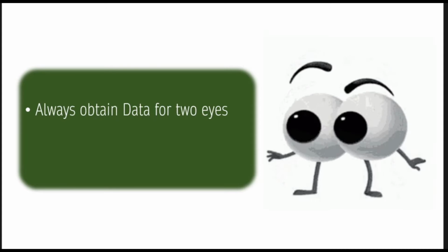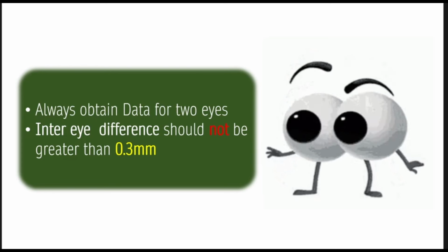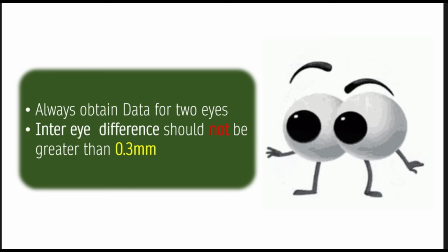Now, whenever we are doing axial length calculation, you always have to obtain the data from two eyes, and if the inter-eye difference of the axial length is greater than 0.3 millimeters, then you have to be suspicious. We'll talk about this in a while.